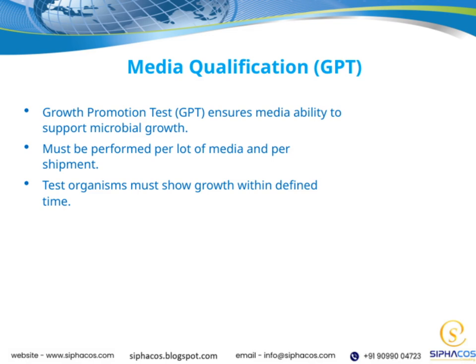The key point here is that the organisms must show growth within this expected period, confirming that the media is functioning properly. Overall, the GPT is a critical part of media qualification, helping us maintain quality control and ensure our testing environment is always reliable.